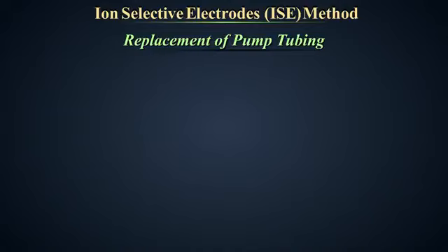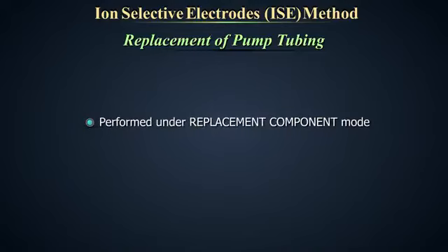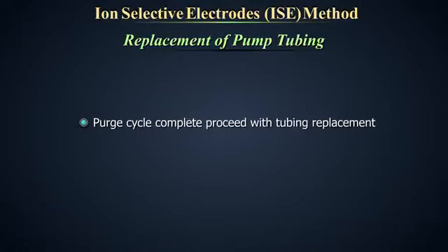Replacement of pump tubing. Replace the pump tubing every 6 months or earlier if the pump tubing appears worn or flattened. The method is described for this particular machine. It may differ in machines from different manufacturers. Perform the action under replacement component mode. Fluid will be automatically purged from the sample flow path. When the purge cycle is complete, proceed with tubing replacement.